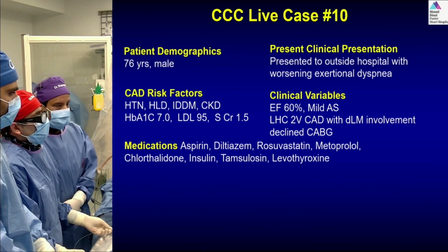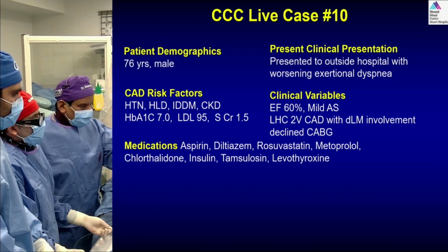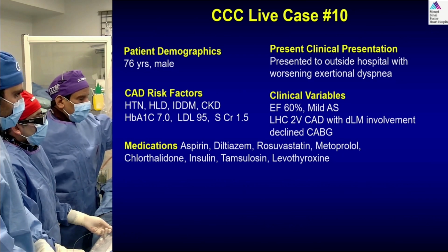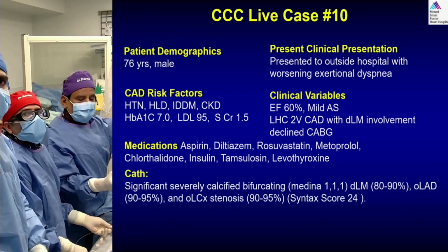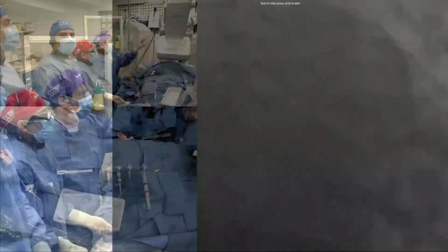This is one of the cases which came in large, high BMI. Did we put a BMI here? From the angiogram point of view, it's very tough to see, and there is a very significant left main disease. The right coronary is non-significant, and there's decreased flow in the LAD. This case is appropriate with the SYNTAX score. If we can go to the angiogram, please.